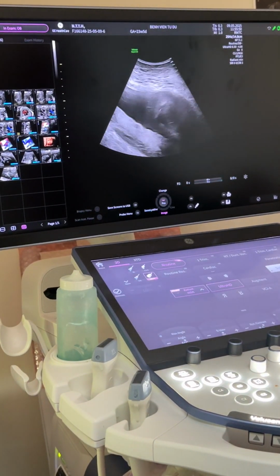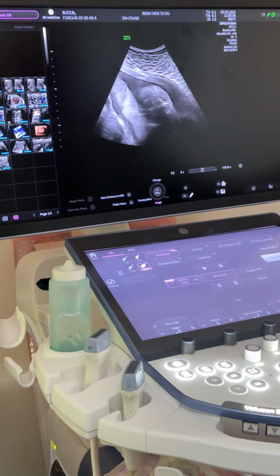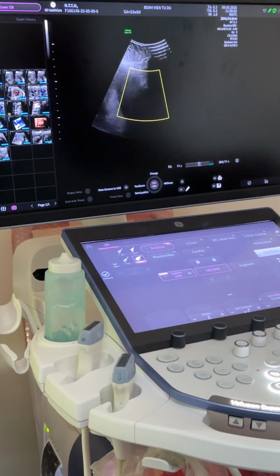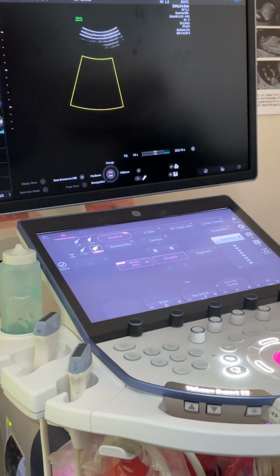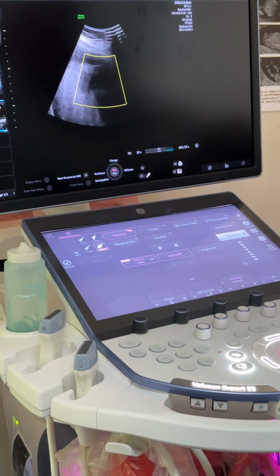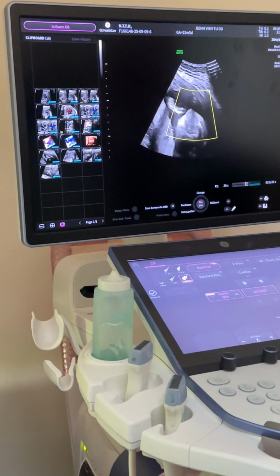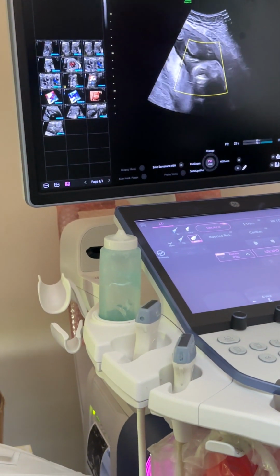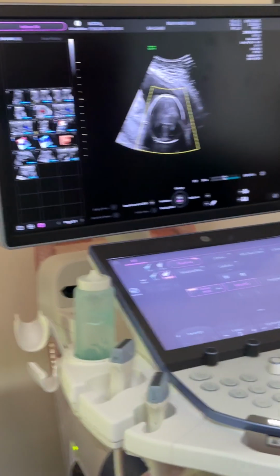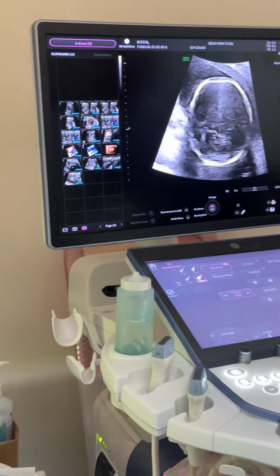Like the corpus callosum, unfortunately, when you were looking at the corpus callosum, the section you want to get is this section here, if I can get it. Can you go over on your side? Turn over on your side for me. Yeah, and just come back. Thank you. Please tell me if I'm pushing too hard. You okay? That's fine. Okay. So, he's fine.